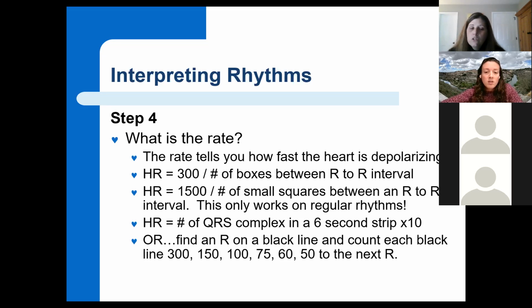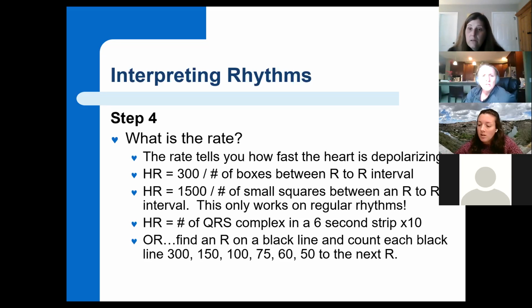The last one, and I'll... Ms. Teeman? Yes. So you just choose one of these ways, correct? Yes, but for testing purposes, you need to know them all. And I'll show you some ways that we can count this out when we look at some of our strip examples here in a little bit.